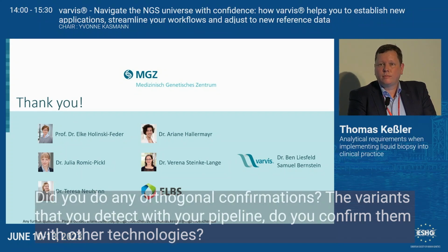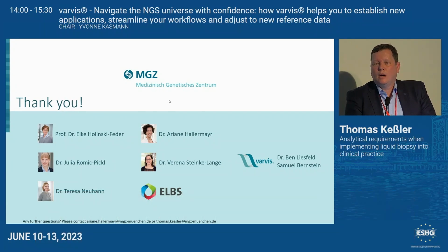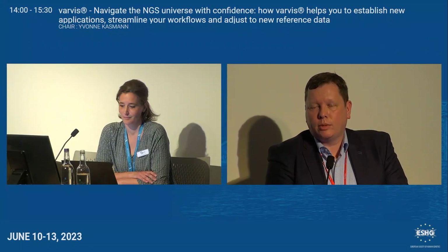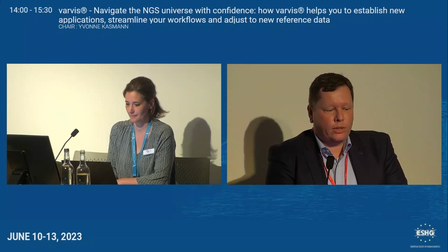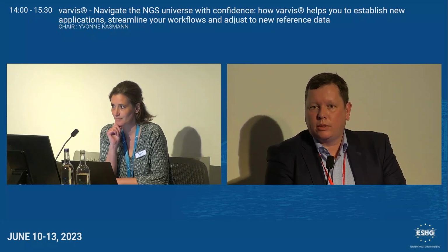Did you do any orthogonal confirmation? Pardon? Orthogonal confirmation, the variants you take from the pipeline, do you confirm them by another technology? You mean if we tested it with orthogonal approaches? I'm sure we did for the establishment of the duplex sequencing, as we are using both ddPCR and duplex sequencing, and we started with the duplex sequencing.